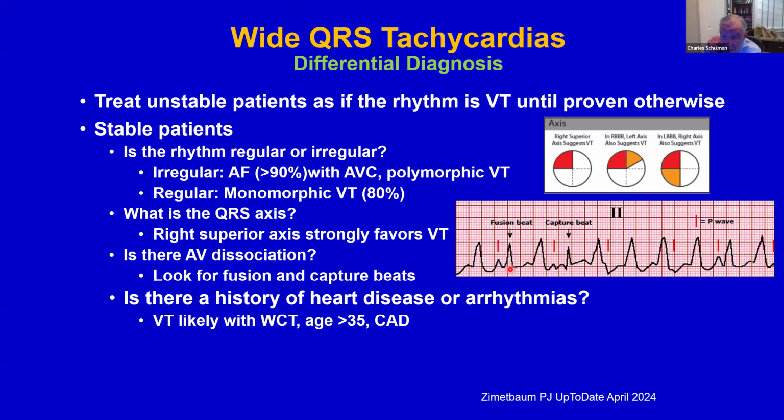Okay, and then sometimes you have fusion beats, which are the meeting of two impulses in the same chamber. Again, a function of AV dissociation.